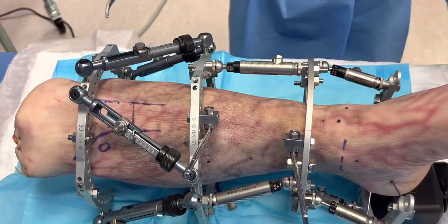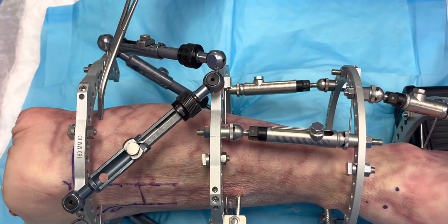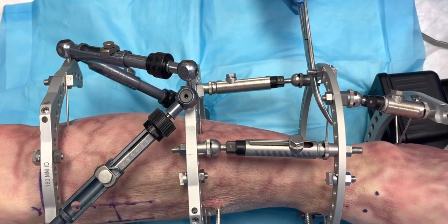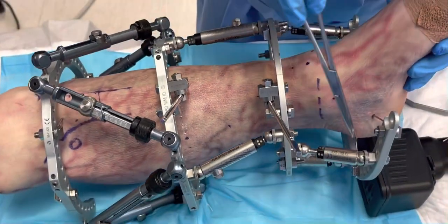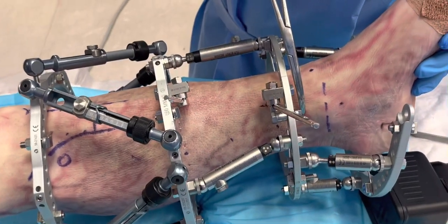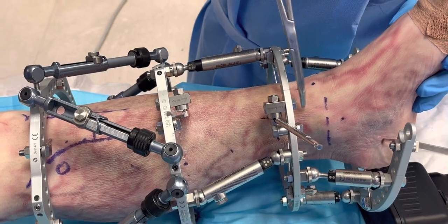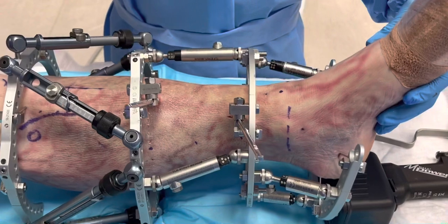But be careful — I'm going to rotate the frame. Careful, this wire had to be a tibiofibular wire, and the same way that this one had to be a tibiofibular wire. Then at this segment, it will be the compression of tibia to calcaneus, or tibia to talus, or it could also be in a post-pylon type of scenario.